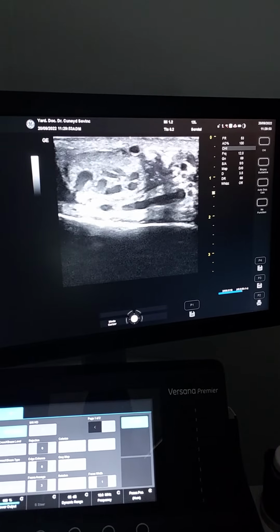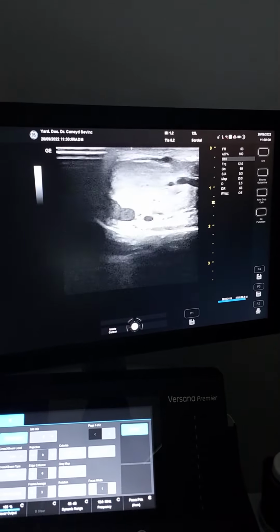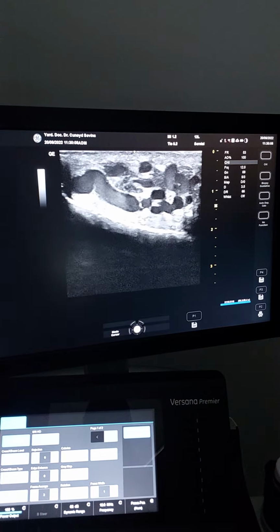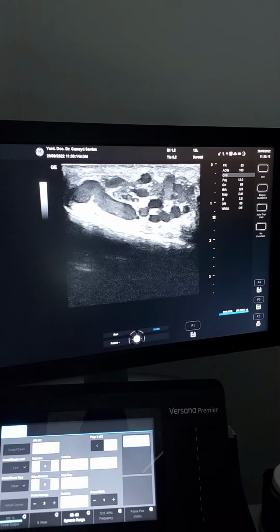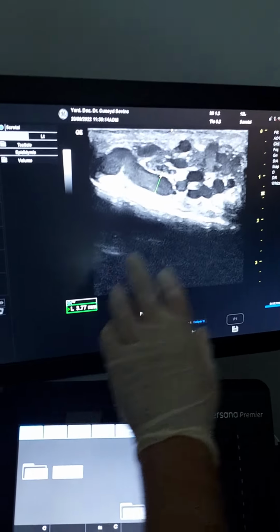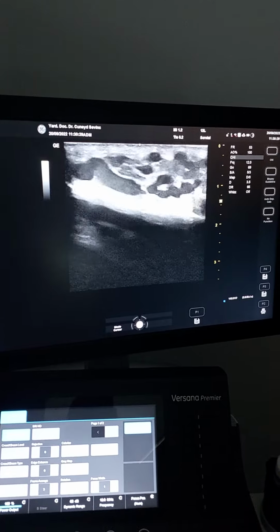His sperm count is 4 million in 1 cc, 1 milliliter, and this is because of the extreme varicocele, and we can easily see there are a lot of veins around the testis. Look at this vein, and this vein is calculated to be 3 millimeter in his Doppler ultrasonography. When I measure this, it's 3.7, 3.8, because we do it when the patient is in standing up position. When we do it like this, the veins are larger.